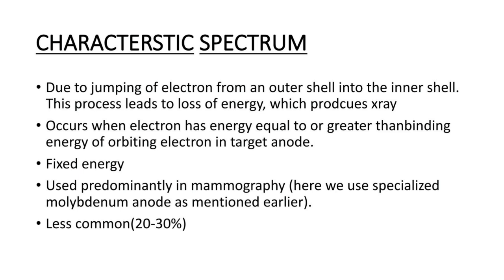As we remember from our chemistry classes, each shell had a fixed amount of energy, so whenever an electron jumps from outer shell to inner shell, it will release a fixed amount of energy. Thus the X-ray produced by this spectrum has a fixed energy level. Another point to be noted is that this spectrum is present more in mammographic scans.